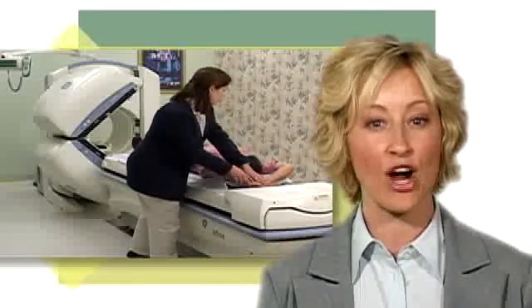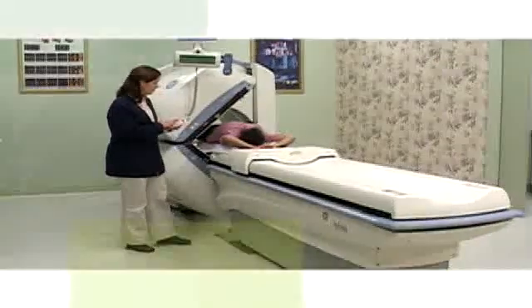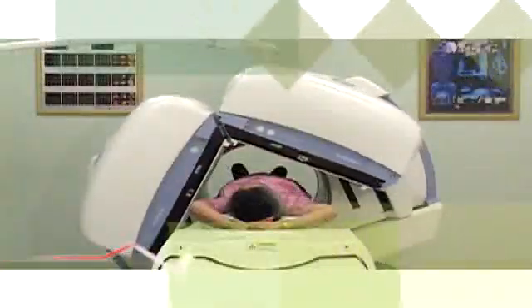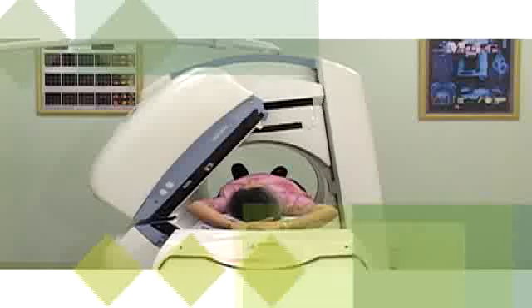The technologist will take pictures of your heart approximately one hour after the injection of the Cardiolite. You will lie down on a special table, and a gamma camera that can detect radiation will visualize the Cardiolite in your heart muscle. The camera is positioned close to your chest and rotates slowly around you, taking pictures as it moves. It takes 20 minutes to take these pictures, and it is important that you lie as still as possible during this time to avoid blurring the images.